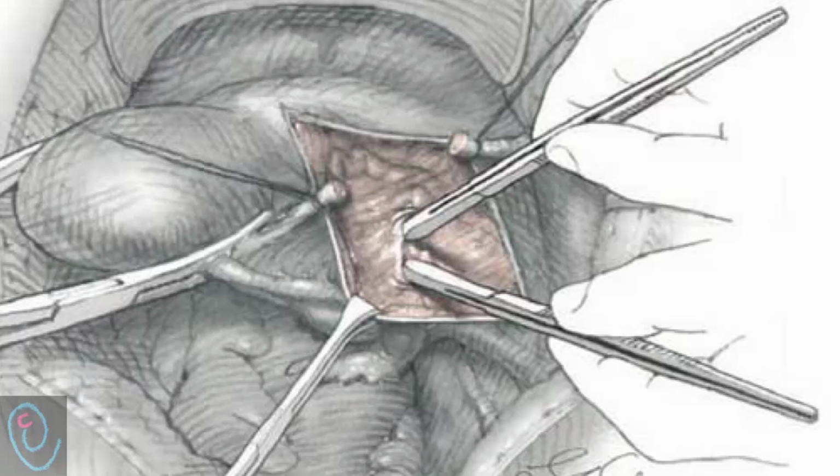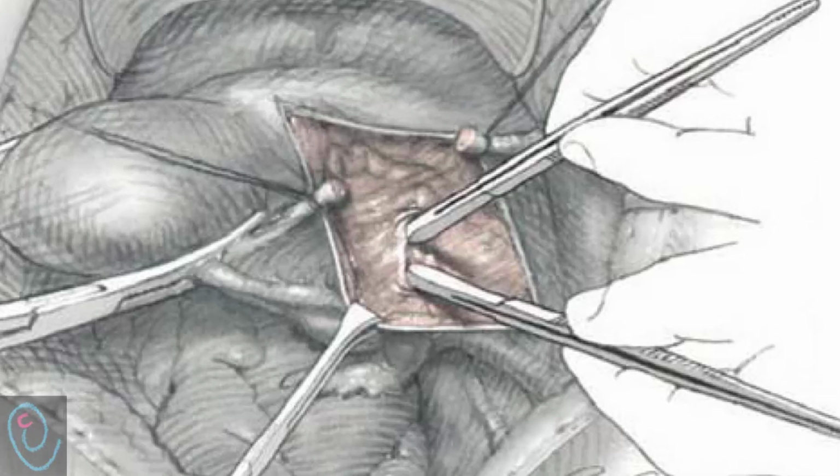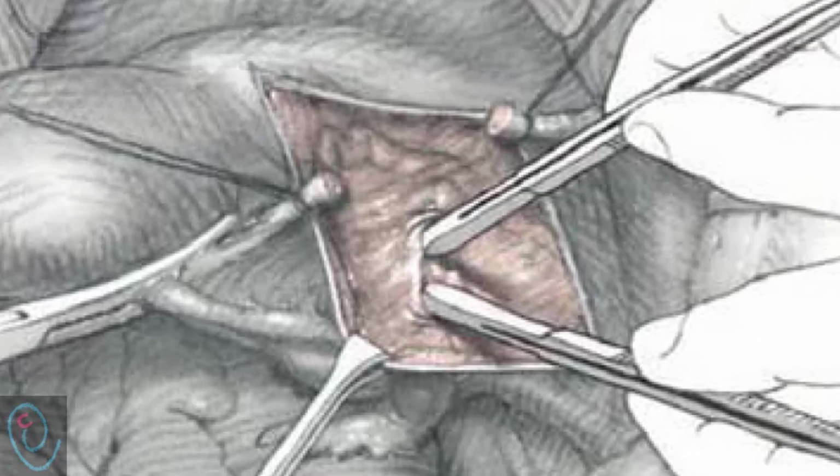Step number 6. Ureter identification. The ureter is identified within the pararectal space, close to the pelvic brim and at the common iliac artery bifurcation. Then it can be traced deeper into the pelvis by localized blunt retroperitoneal dissection.